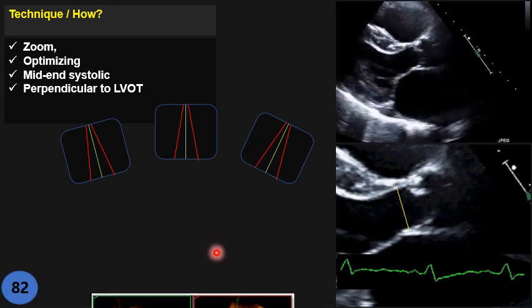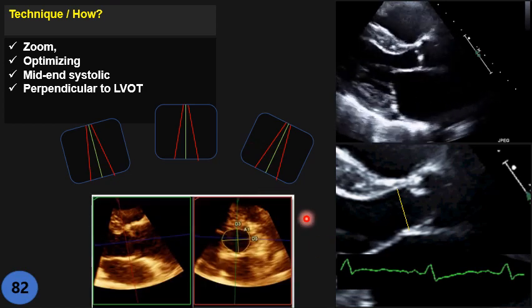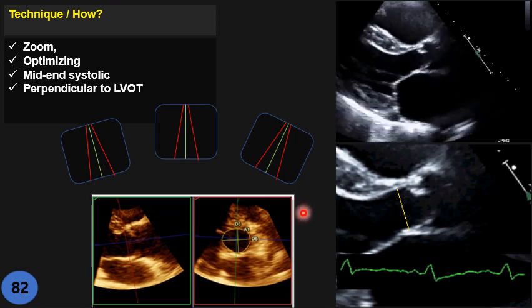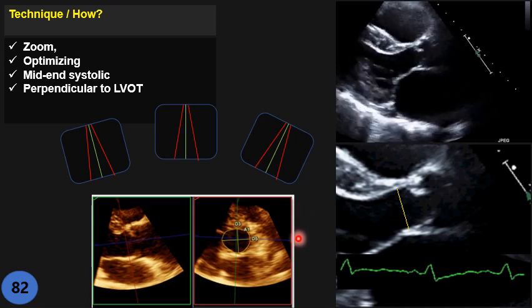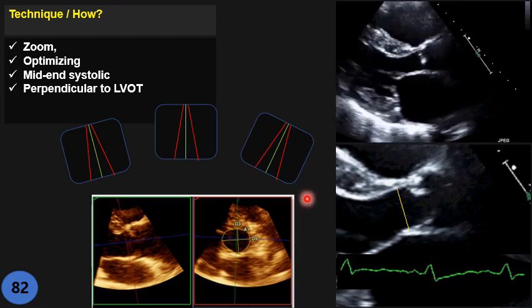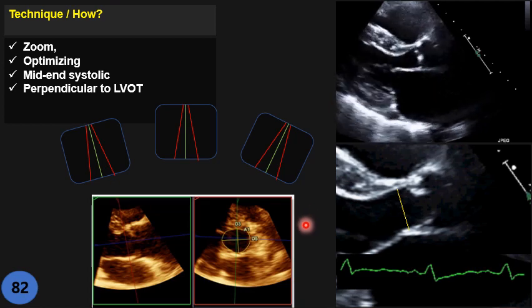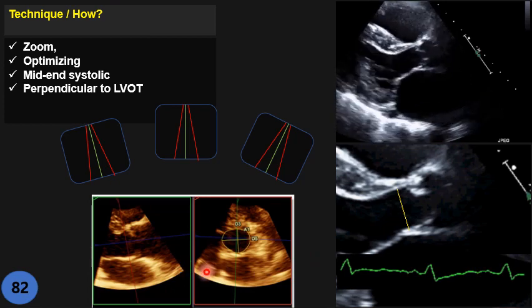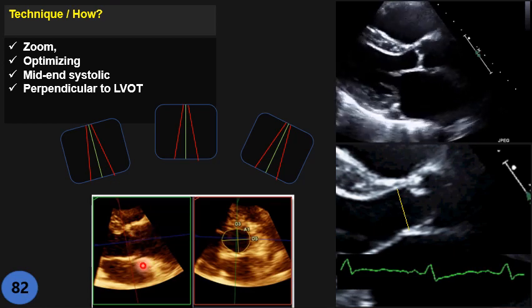Don't forget — all this measurement is based on the assumption that the geometry of the LVOT is cylindrical and circular, which is correct in most patients. But in a significant number of patients, the LVOT is actually oval-shaped, not circular. In those cases, the best technique is 3D echo, biplane, or CT scan. I will talk about that in detail in the aortic stenosis lecture.